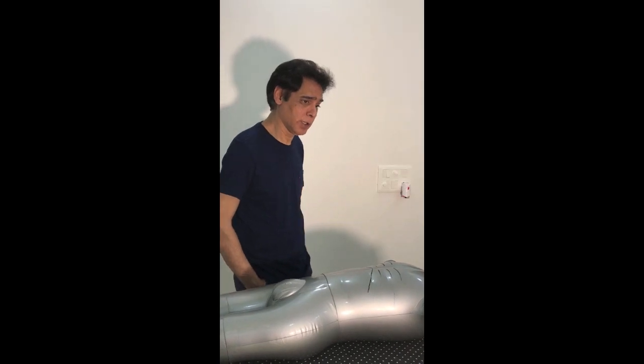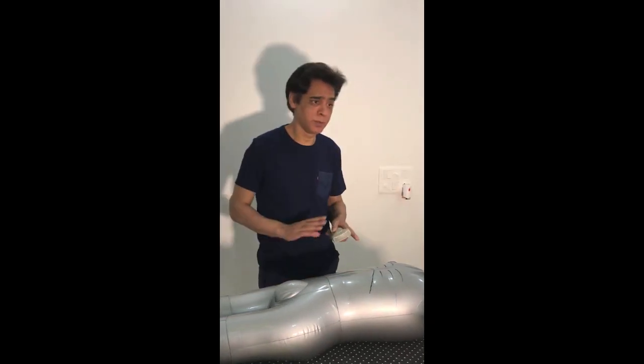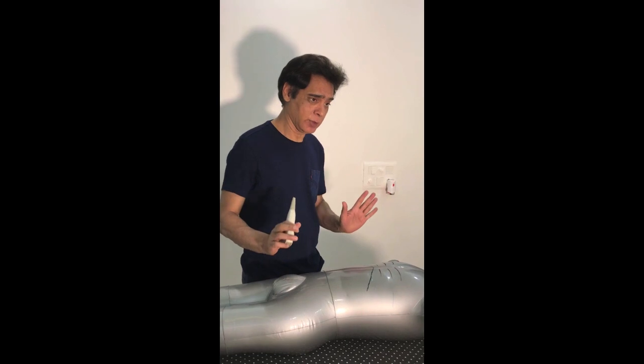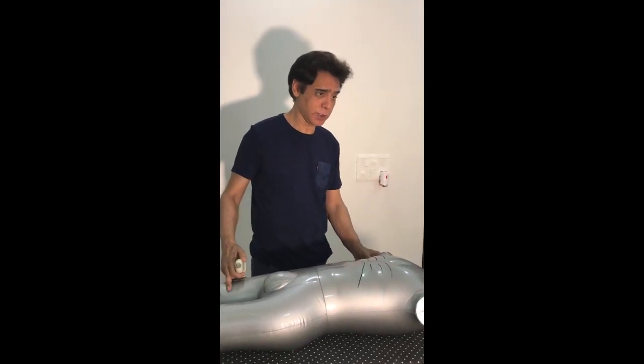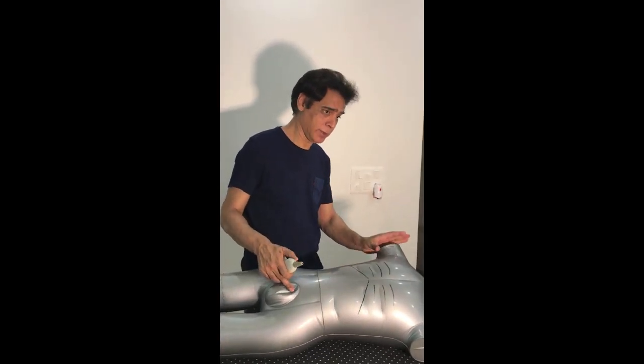So I start with focusing from the proximal position. Now, the patient is lying supine, and we just turn the patient into an oblique position with the right side up.